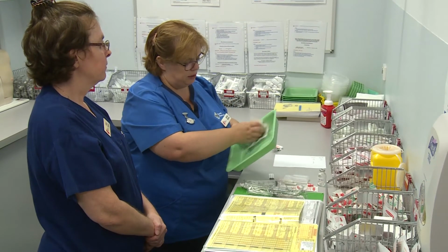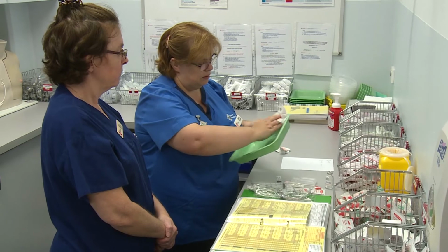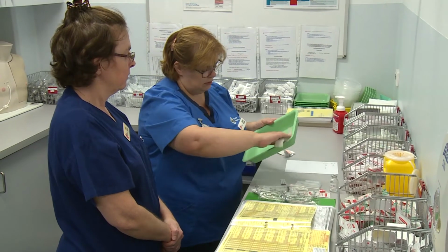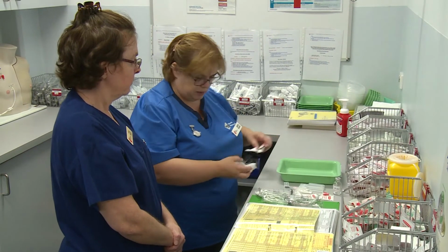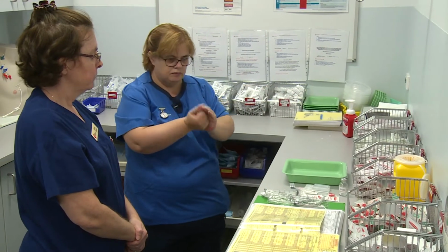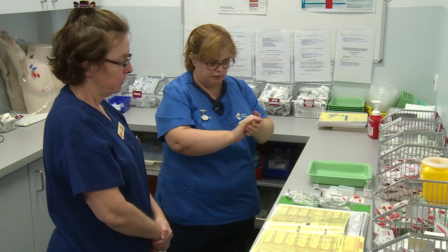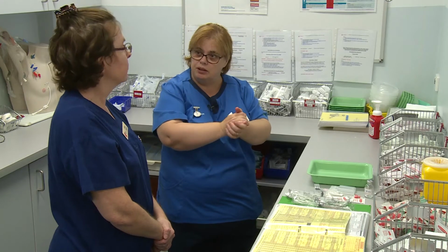And I'm just going to clean my tray. Put that in my bin. And my hand hygiene again. And then while that's drying, I'll do my first check with you.